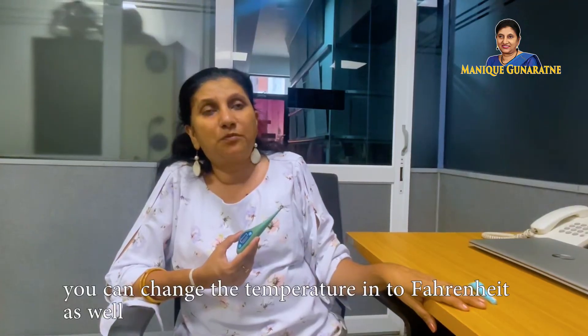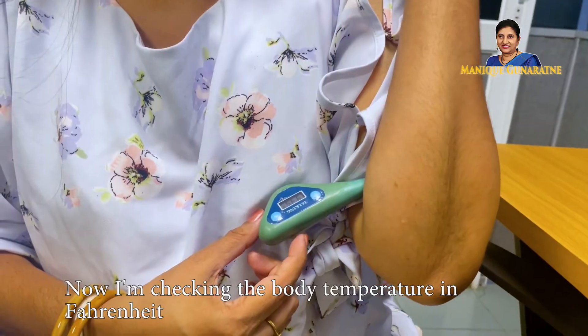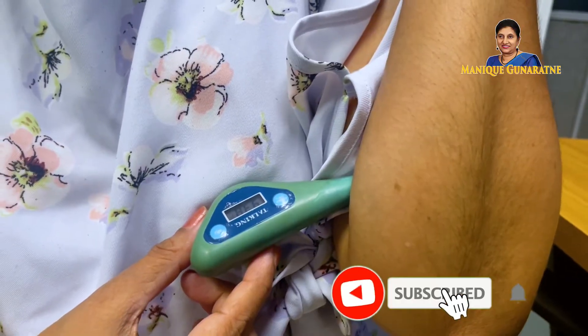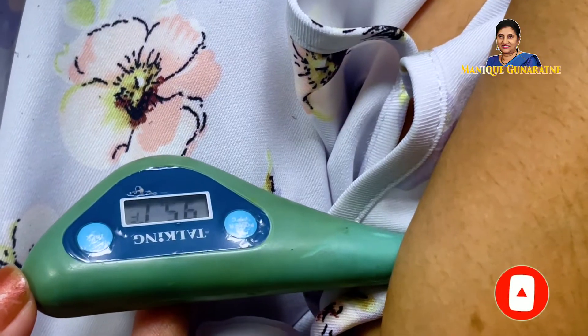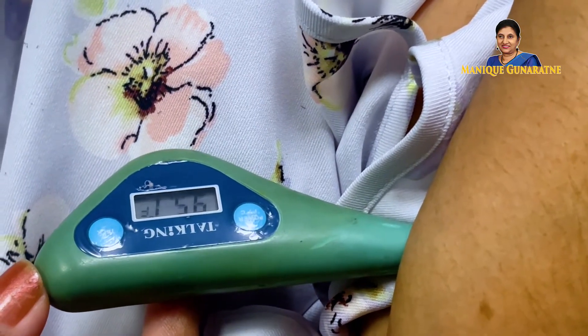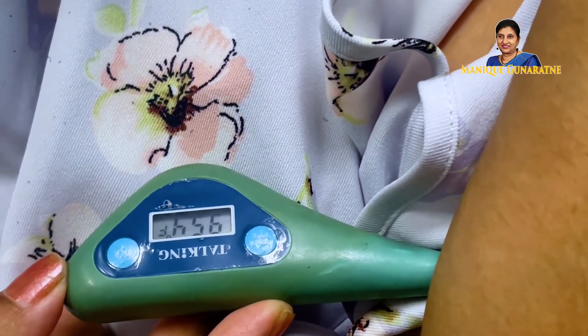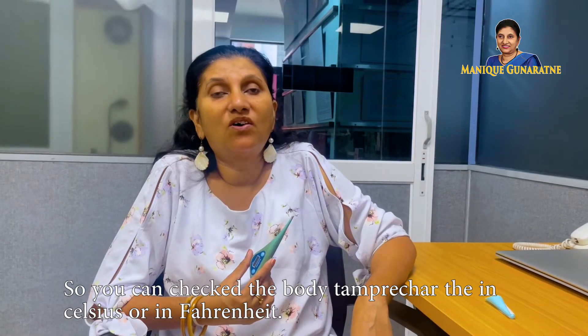You can change the temperature into Fahrenheit as well. Now I am checking the body temperature in Fahrenheit. So you can check the body temperature either in Celsius or in Fahrenheit.